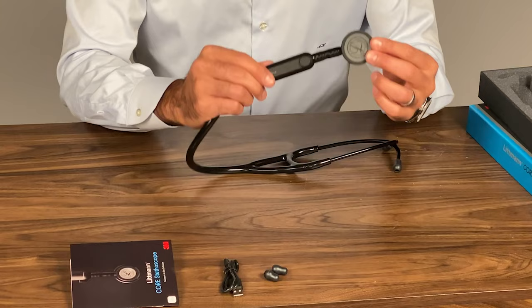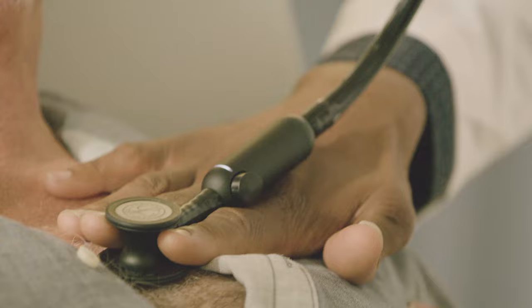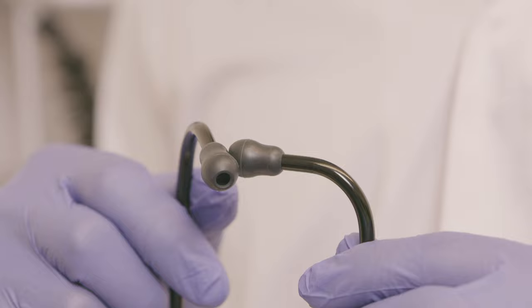The ECHO Core Digital Attachment is an impressive piece of technology that I've been using since it was released. Basically, it has a little microphone on the inside that brings in the sound, cleans it up, filters it, and then sends it through into the earpieces.